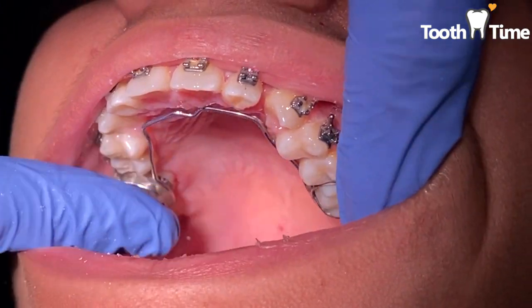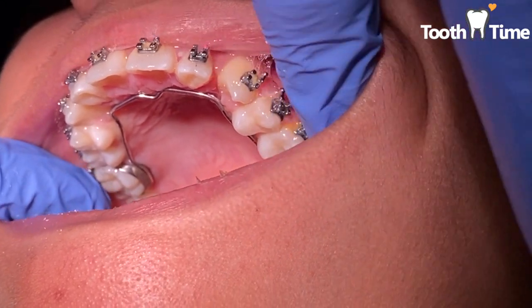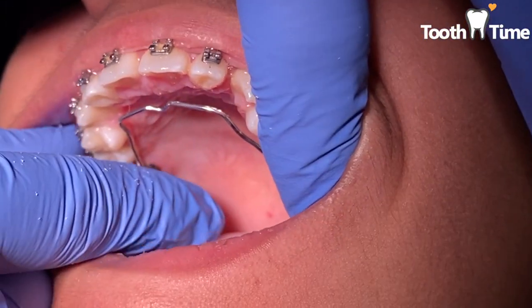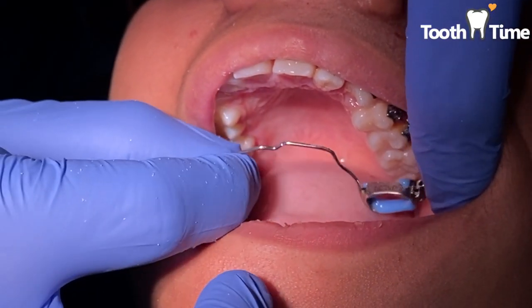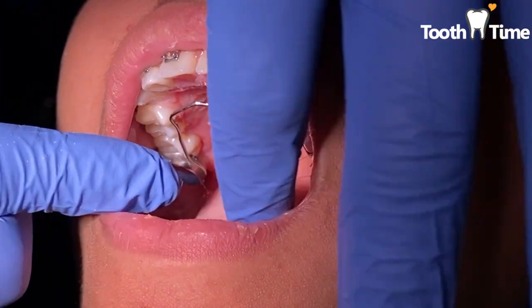Because as you can see here, we removed the plastic, like the bite plate, the plastic part, and then we're gonna put the anchor back on to maintain anchorage and avoid shift from the molars.